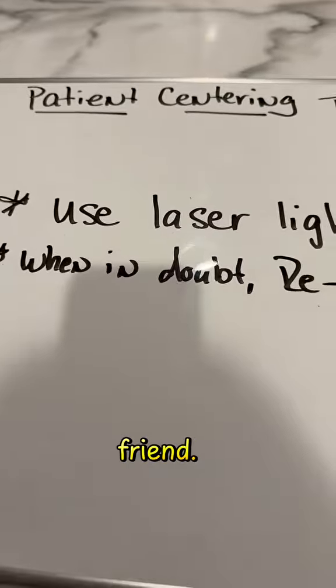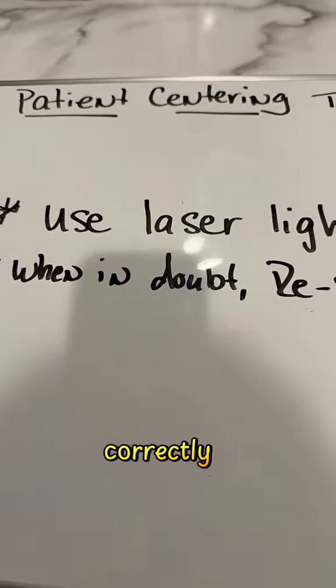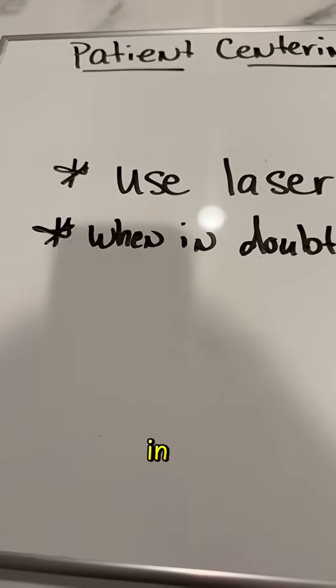It is your friend. It will go ahead and make sure that your patient is centered correctly so the system calculates the correct amount of dose. And when in doubt, rescout.